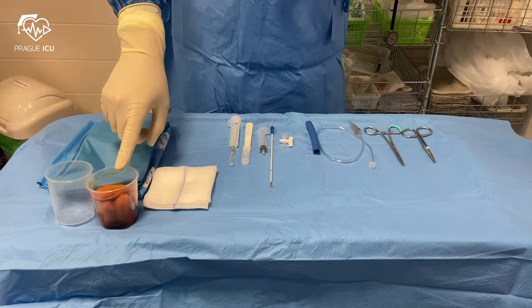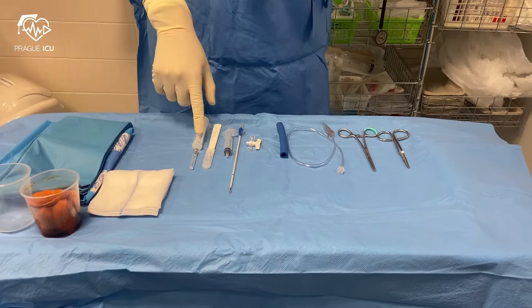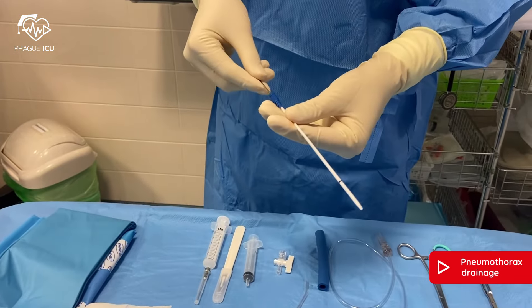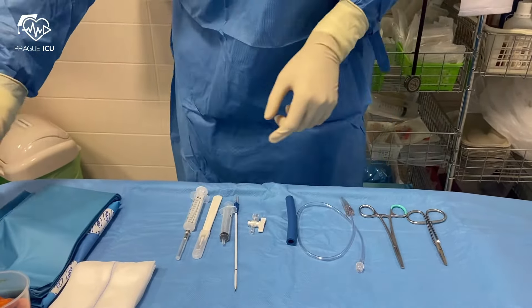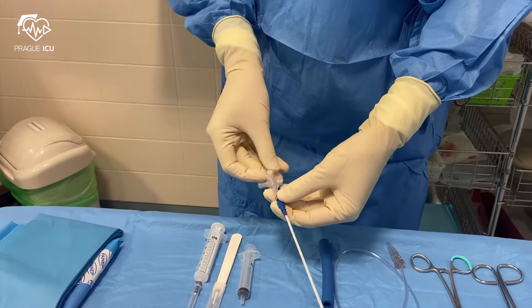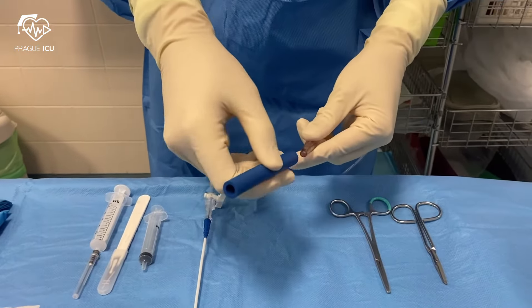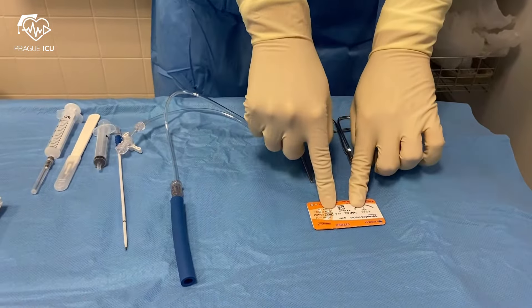On the sterile trolley we have local disinfection Chlorhexidine, sterile drape and gauze, a syringe with a needle for local anesthetic, a scalpel, and a small size 8 French catheter. The catheter has a sharp metal stylet inside. There is also a 3-way stopcock that is attached to the end of the catheter, connecting tubing with a connector that is attached to the suction system, and finally we will also need a suture kit.